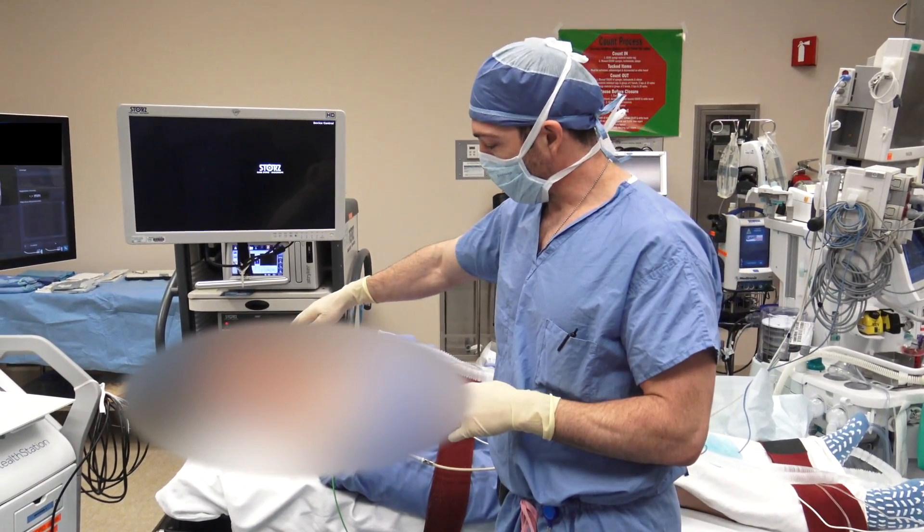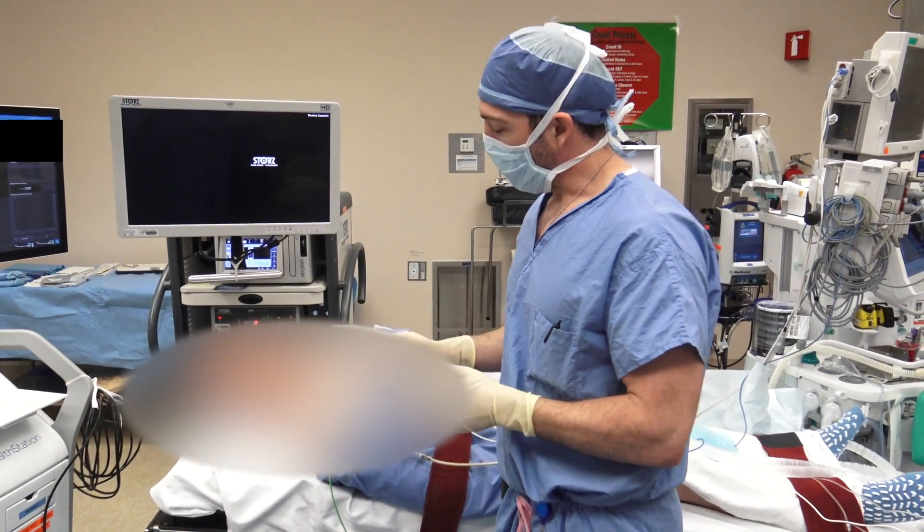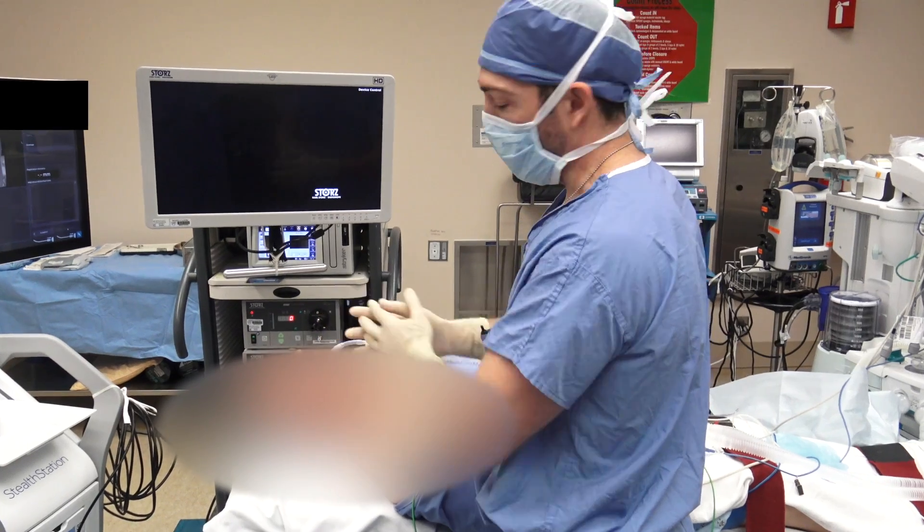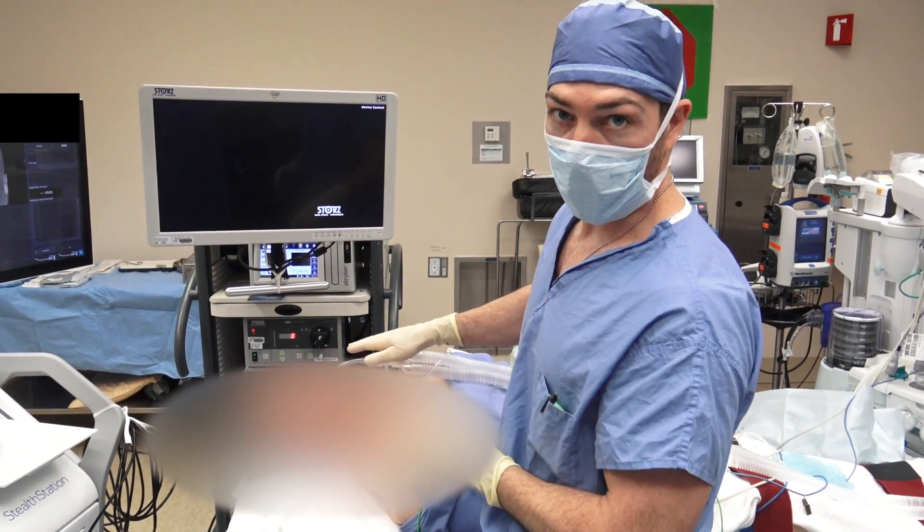We usually get the endotracheal tube taped at the left lower lip. As we work through the nose from the patient's right side, that allows us full access to the nose without having impingement from the endotracheal tube.